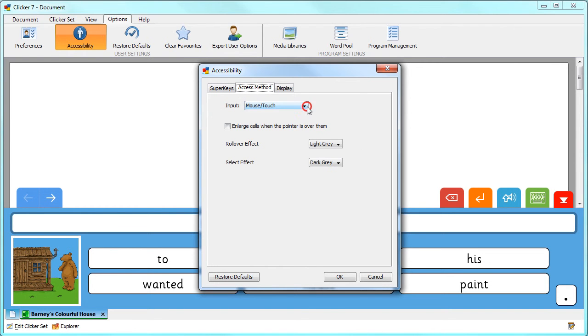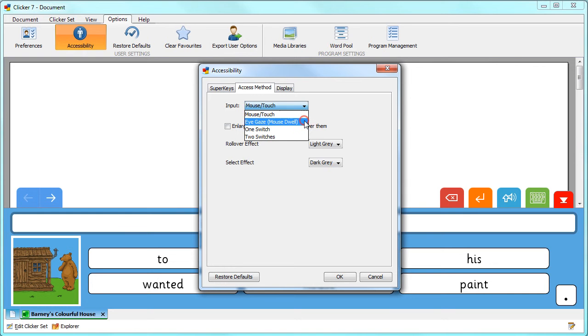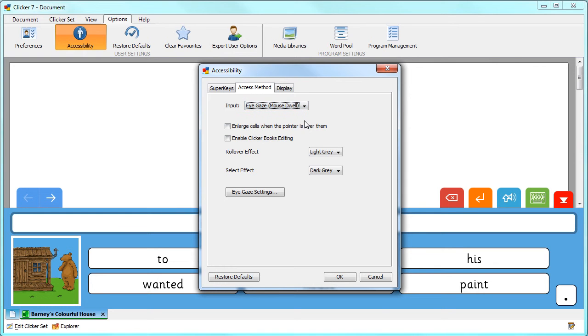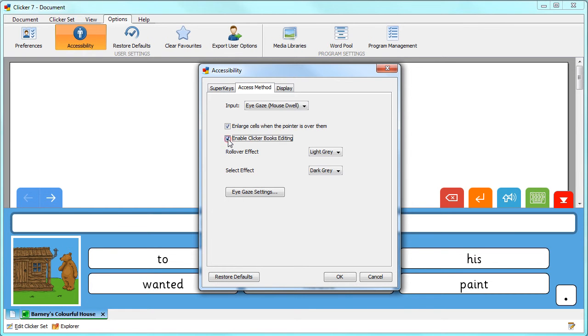From the Input box, choose EyeGaze. Here you can choose to enlarge the cells when the pointer is over them, and choose to allow learners to edit Clicker books with EyeGaze.